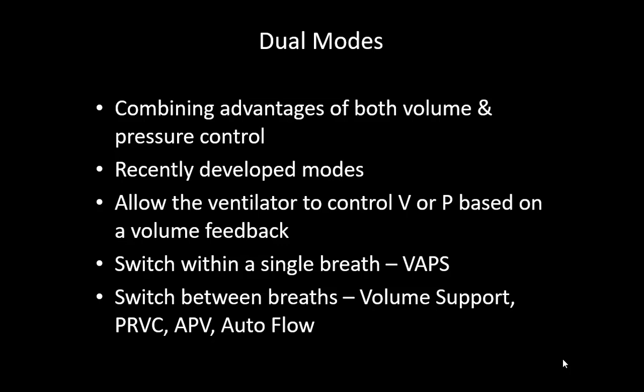Mainly it is a deceleration type of inspiratory flow, which is helpful in the pressure control mode. Of course, it decreases the barotrauma. These are not recently developed modes. They have been in the market for more than 15 years, maybe 20 years. They allow the ventilator to control volume and pressure based on volume feedback.